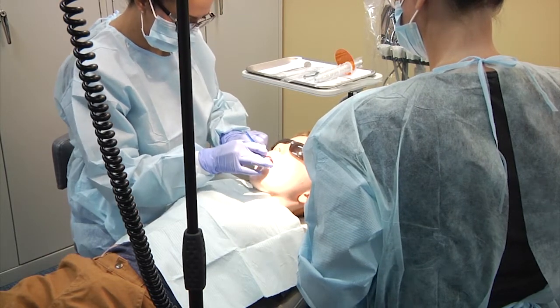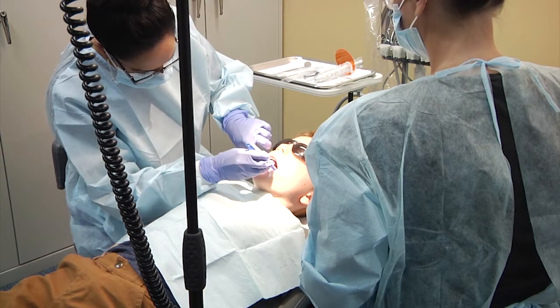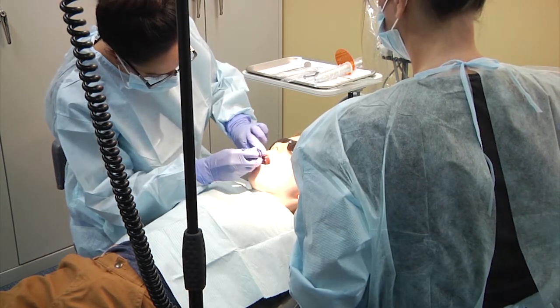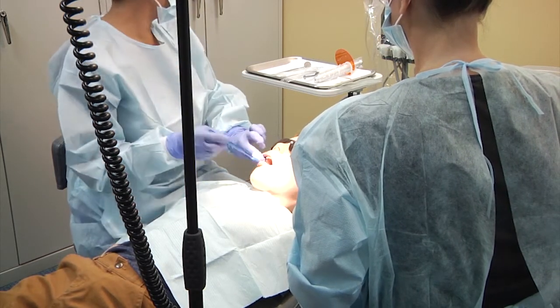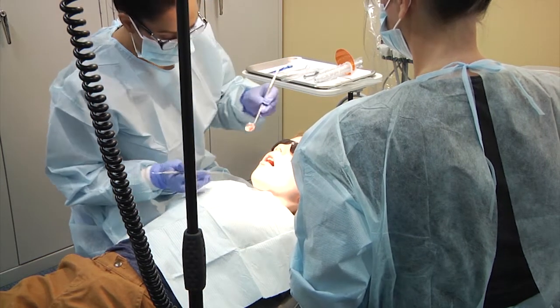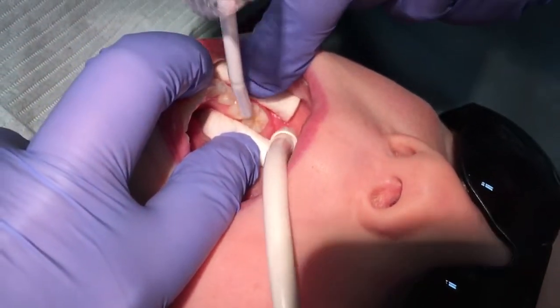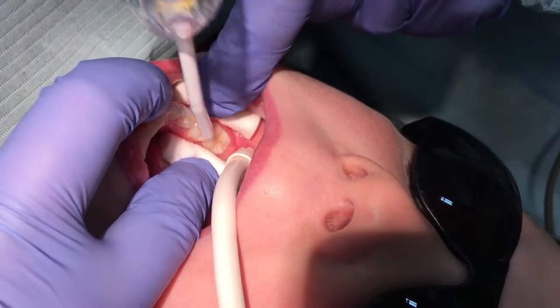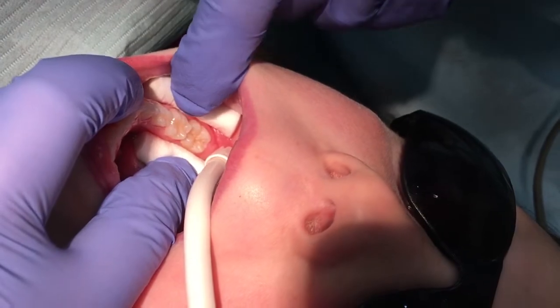The provider must then check the surface for cleanliness by using an explorer appropriately, as recommended by the American Dental Association — use the explorer to check gently the cleanliness or texture of the tooth without scratching or damaging the tooth's surface. Prior to etching, isolate the tooth and dry the occlusal surface. Some research suggests drying for 20 seconds. The point is that the tooth must be thoroughly dried before etching.